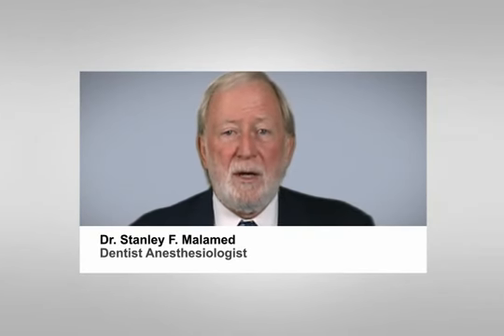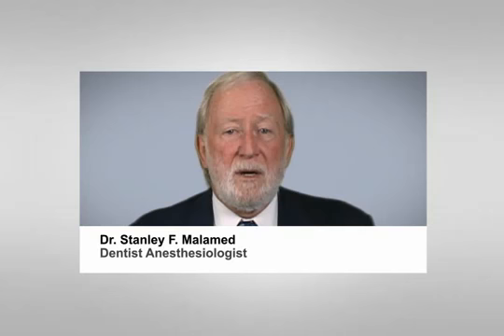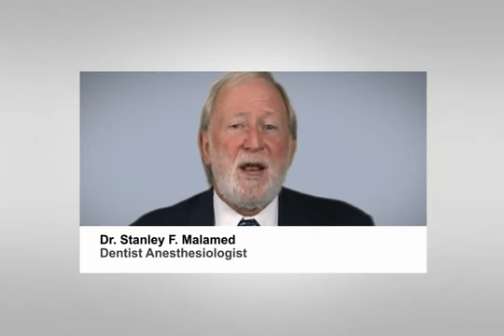The PASA injection is very useful for those dental procedures performed in the maxilla. It effectively provides profound soft tissue and pulpal anesthesia of multiple maxillary teeth from a single injection without producing collateral anesthesia to the lips and face, thus allowing greater post-treatment comfort. Additionally, those procedures that require a more accurate assessment of the patient's smile line during treatment, such as aesthetic restorative dentistry, can be accomplished with this maxillary injection with no drooping lip.